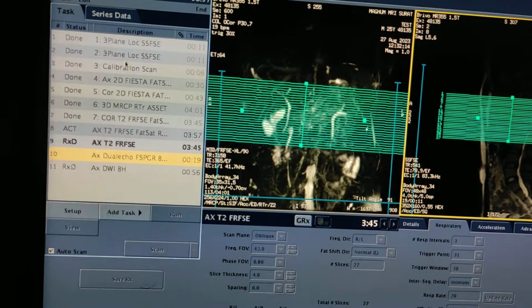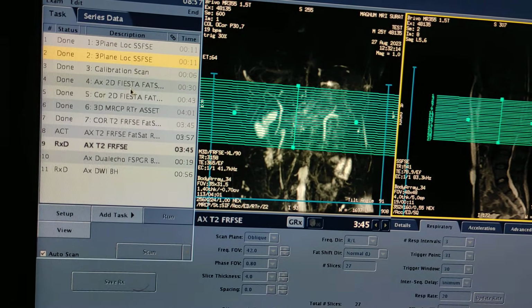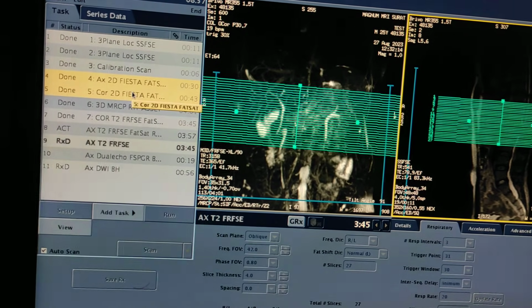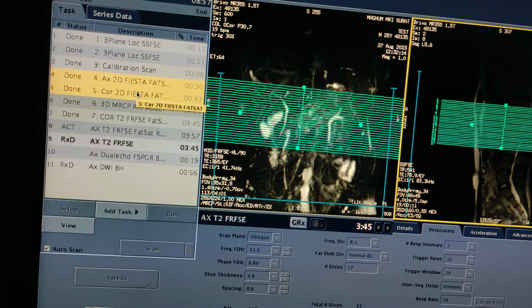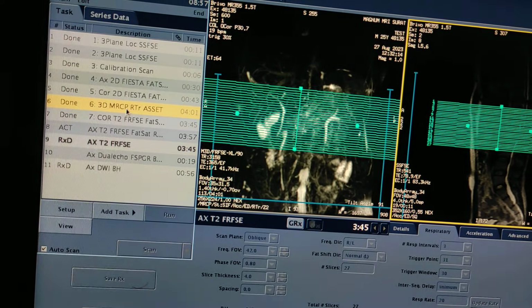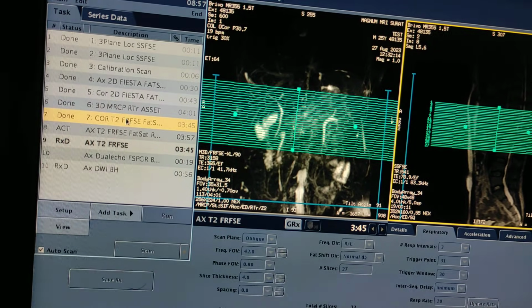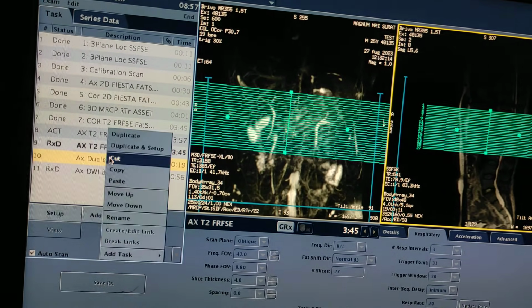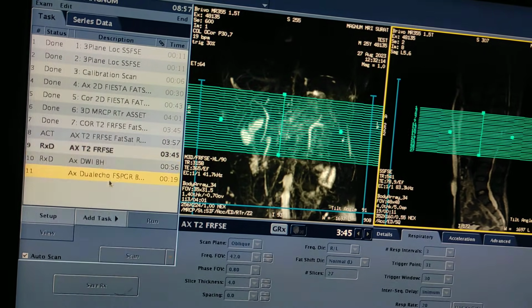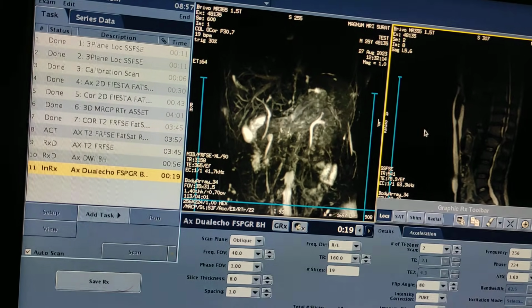First of all, you have to take the localizer. Then you have to run 2 Fiesta sequences, axial and coronal, for better planning. Then you have to plan the 3D sequence. Then after that you have to plan coronal T2, then axials, then DW, and lastly you have to take dual echo to check the sludge in the gallbladder.